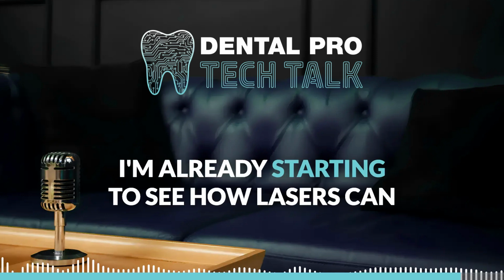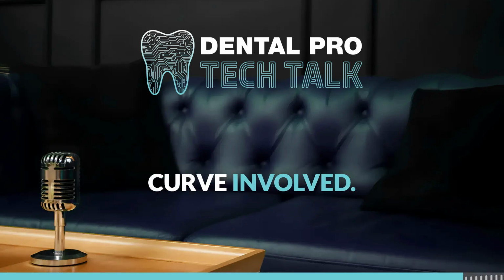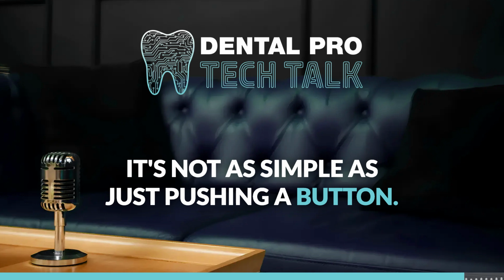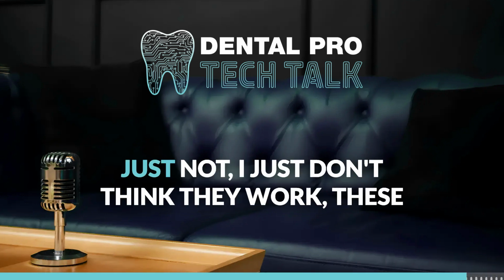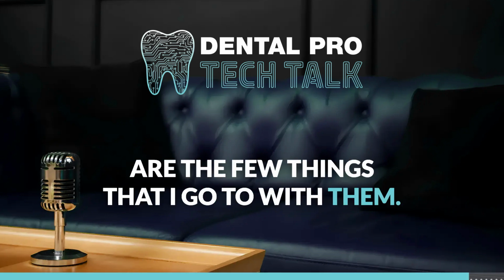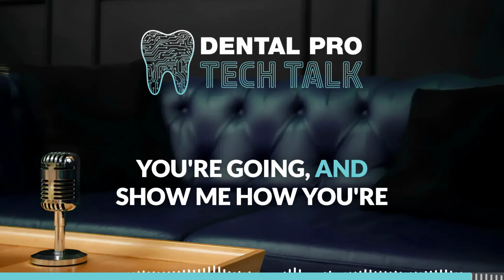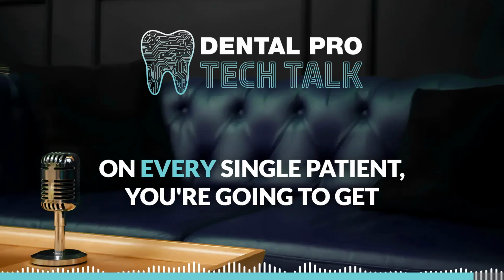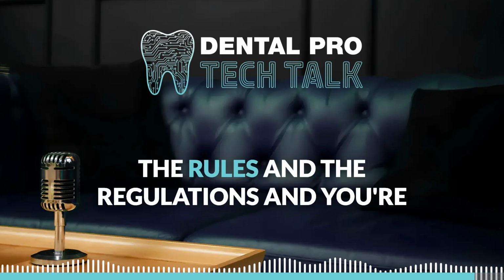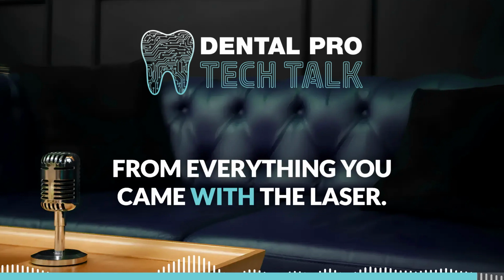Absolutely. I'm already starting to see how lasers can transform a dental hygiene practice, but it's also clear that there's a learning curve involved. It's not as simple as just pushing a button. Whenever somebody tells me that they hate a laser and it doesn't work for me, I just don't think they work, these are the few things that I go to with them. Tell me what setting you're using. Show me how fast you're going or how slow you're going, and show me how you're placing that fiber. Because if these three things are followed on every single patient, you're going to get all of the great takeaways from everything you can with the laser.